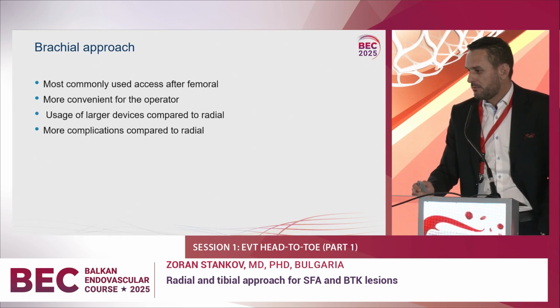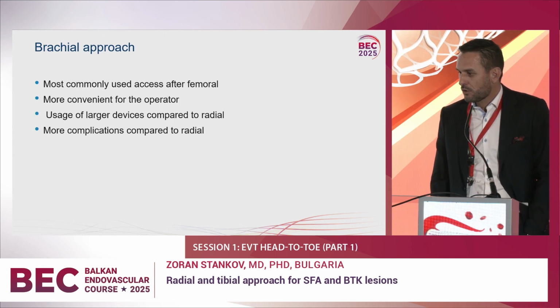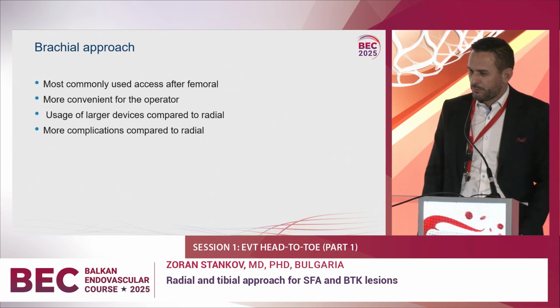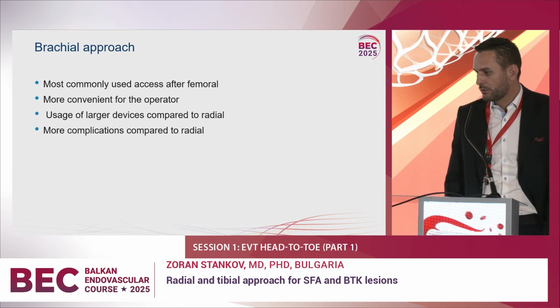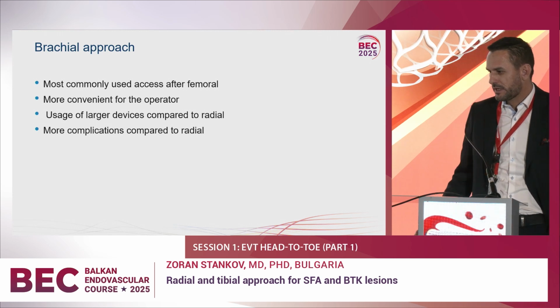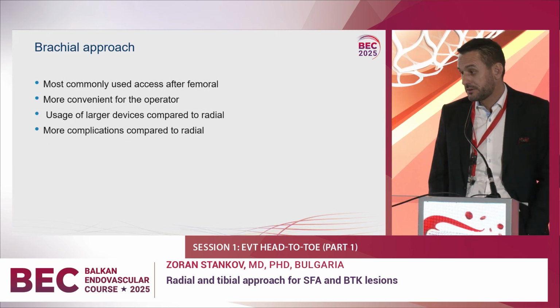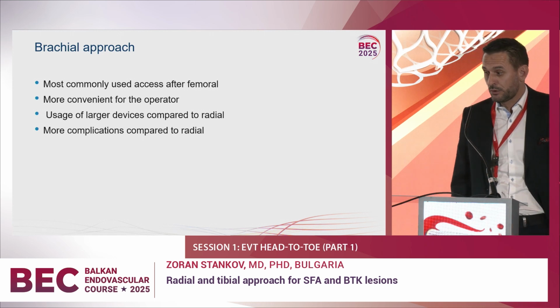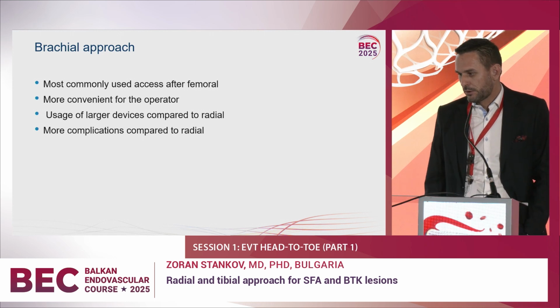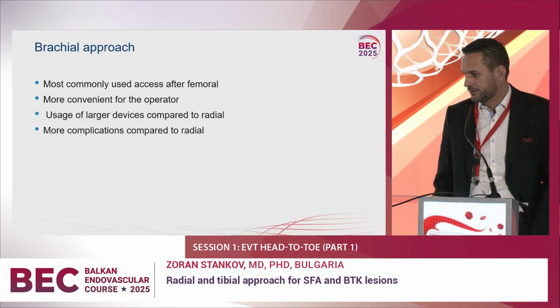It's more convenient for the operator, using large devices, compared to the radial, with more complications compared to the radial, but compared with the femoral approach, there is no difference. We have a publication comparing radial and brachial approach in 2,000 patients, and the result is that the brachial approach is safe for peripheral intervention. We use it for coronary intervention.